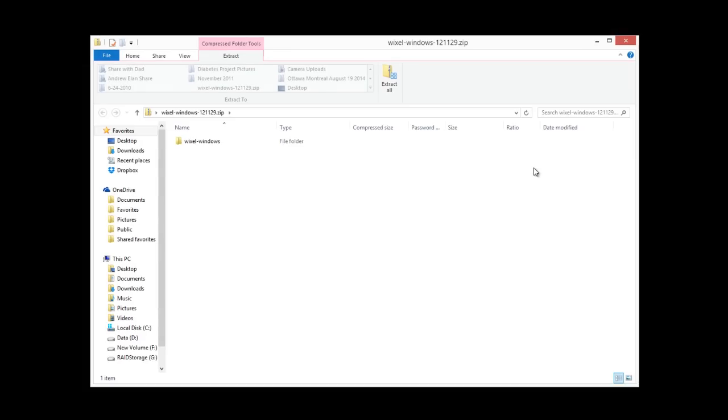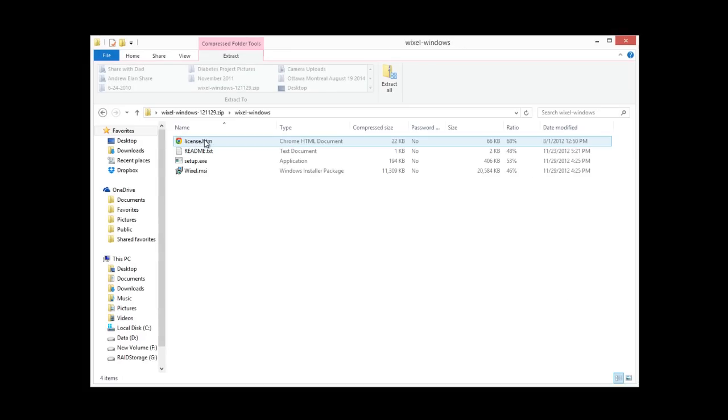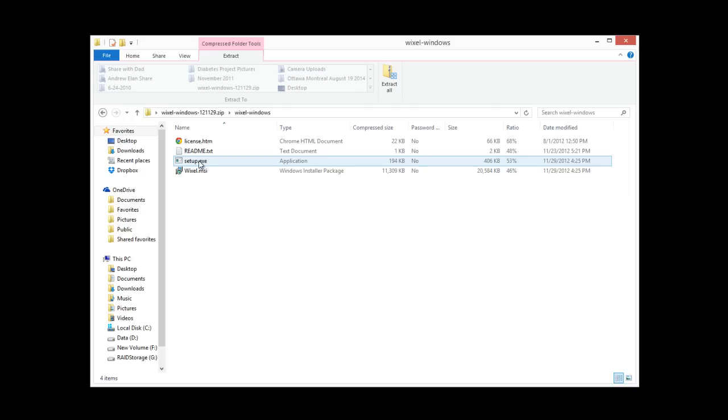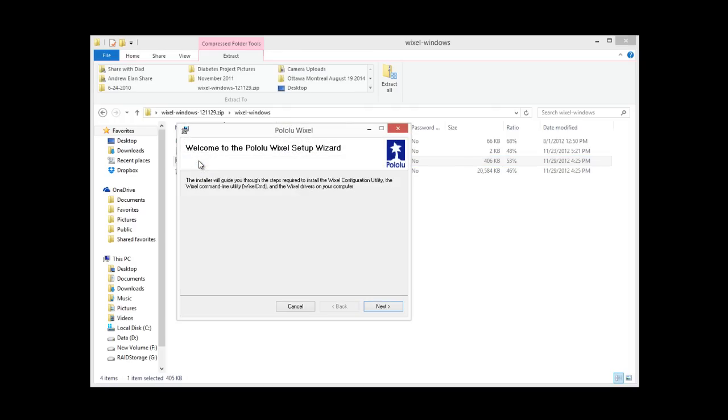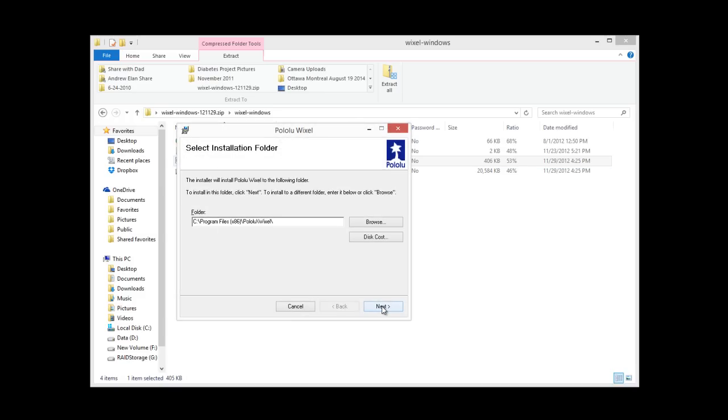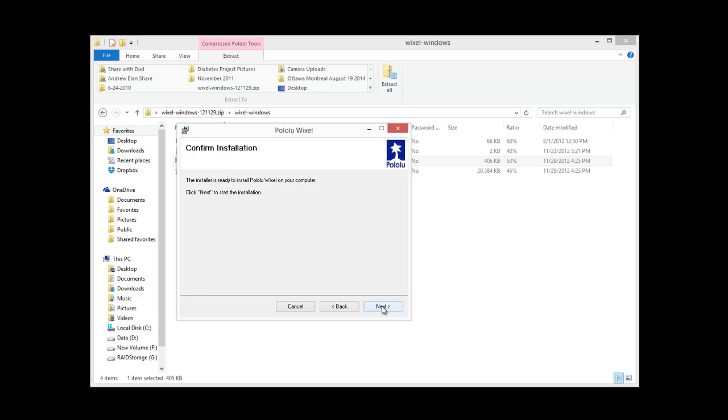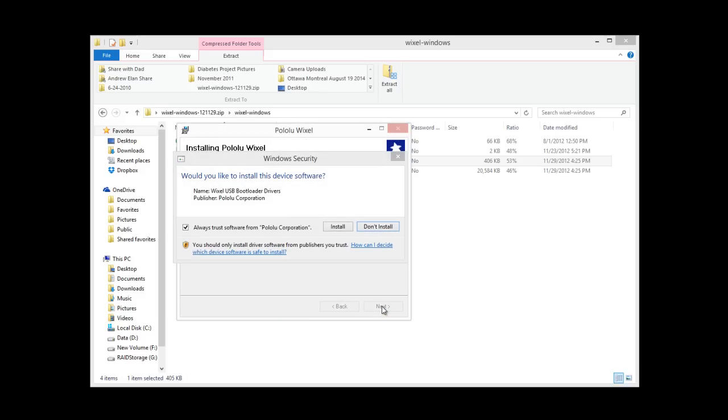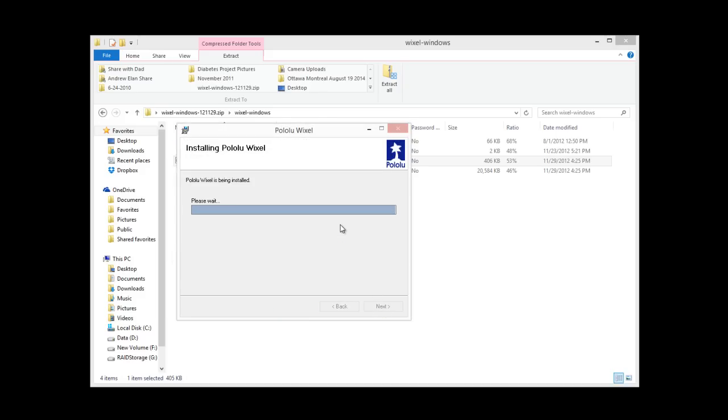And the next thing we're going to do is install that Wixel software. So we'll go into the folder and click on setup.exe. And just go ahead and hit next, and it'll install, and then we're done.